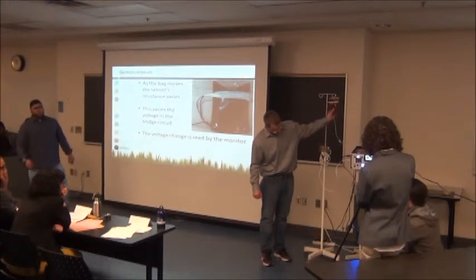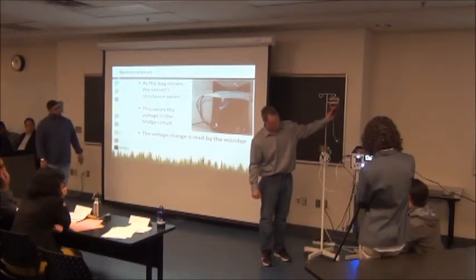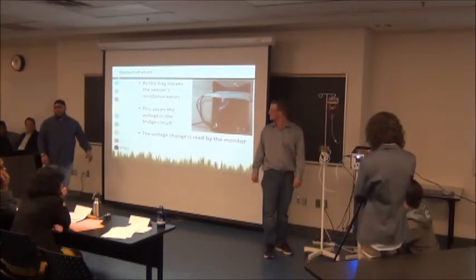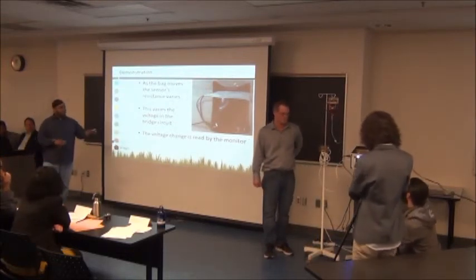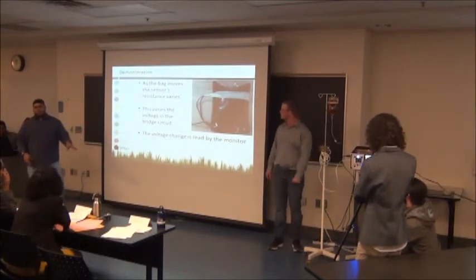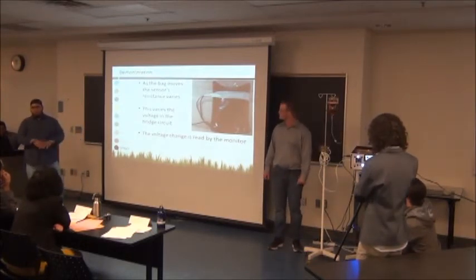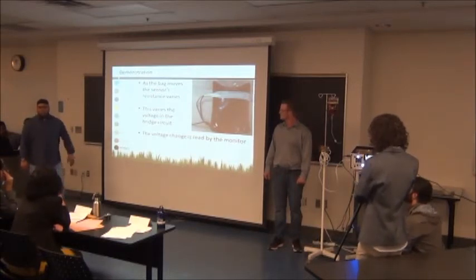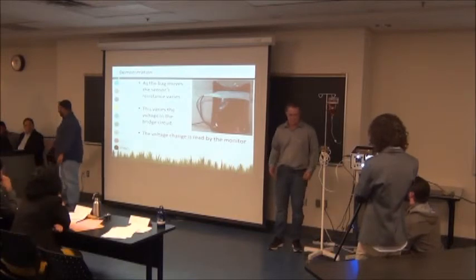And it also triggers the alarm. Beats per minute indicator. Yep, that's the beats, and all the alarms are going off, because this way we can test the full range of the device, all the way from 0 to the maximum, and the vitals and everything. And that's what we did.